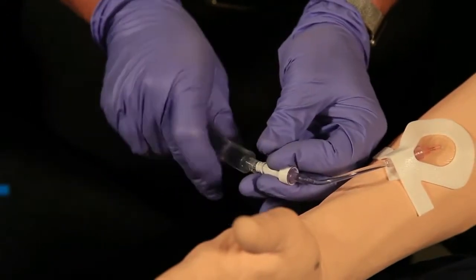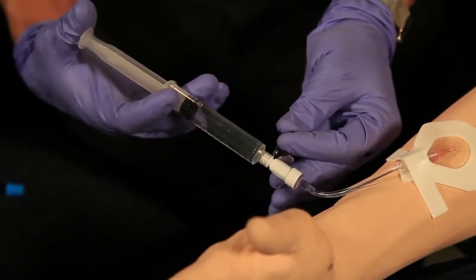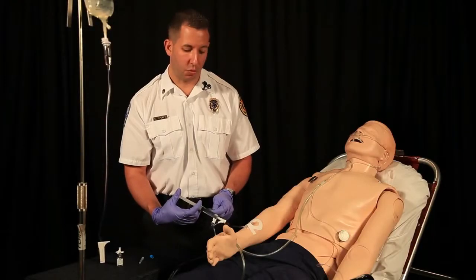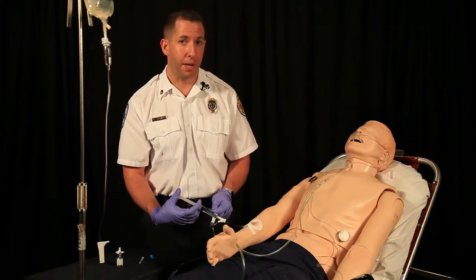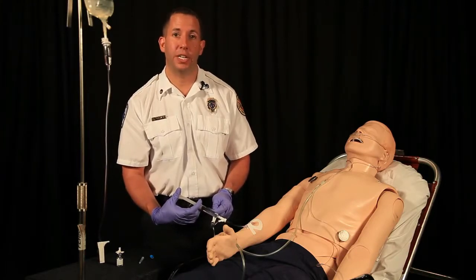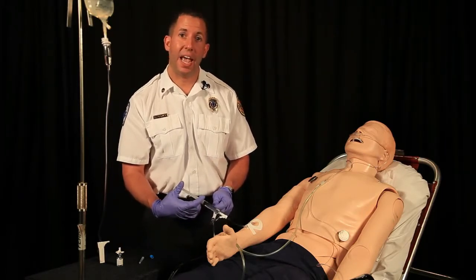We're going to hook it up to our J-loop or our IV tubing, and this is going to be a slow IV push. We should be delivering this roughly over 1 to 2 minutes, and if we push too rapid, it's actually going to cause the patient to have a laryngospasm. So we want to avoid that high dose concentration without normal saline and rapidly pushed.